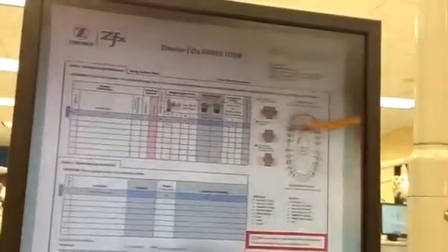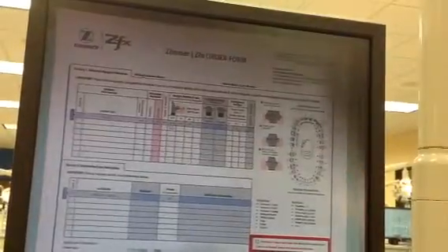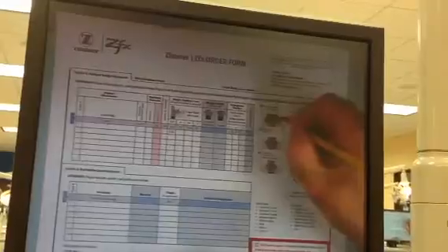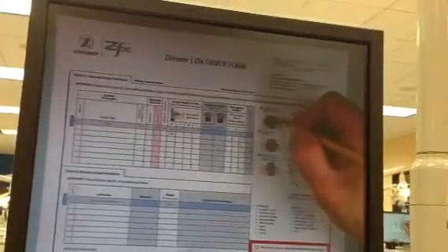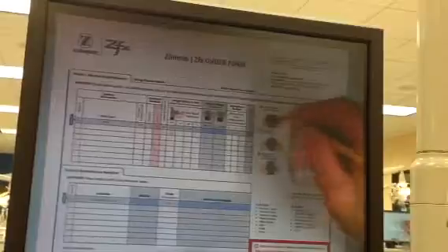What this allows you to do then is pretty much cement retain any prosthesis that you want by having multiple units. The only time that it won't work is if you've got 3 millimeters or less on a single crown. I don't really want to cement it. I want to screw retain it, just because I'm worried about the length and the fact that I use a provisional cement.